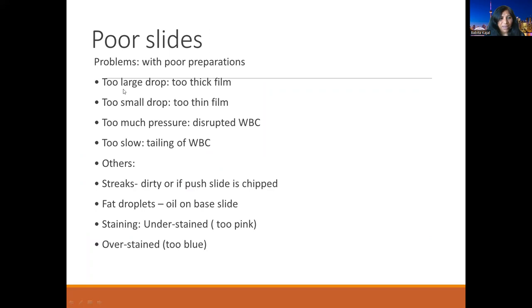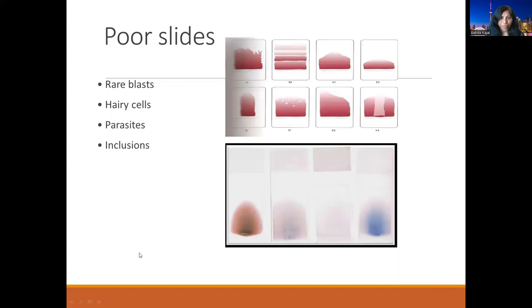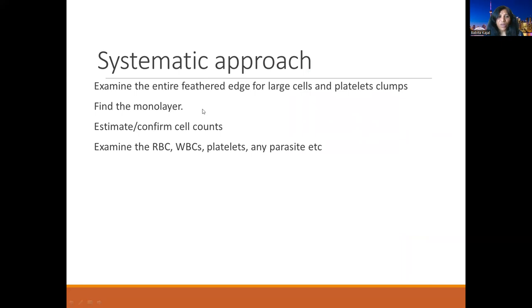If we don't have proper slides, those are poor slides. Poor slides can be caused by: a blood drop that is too large (making thick films), too small (making thin slides), too much pressure (disrupting cells), or being too slow (causing tailing of RBCs). Other problems include streaks, oily hands, and staining problems such as understaining or overstaining. With poorly made slides, we might miss blasts, hairy cells, parasites, and organisms.